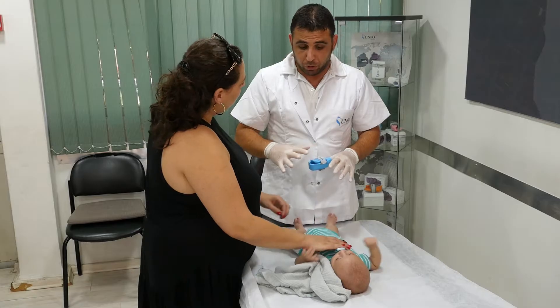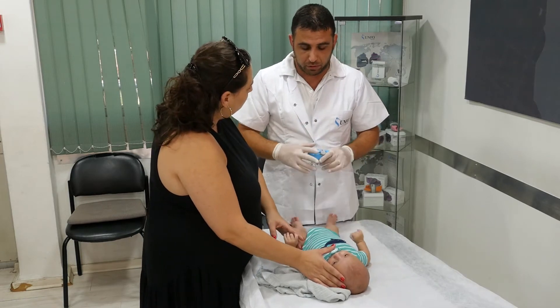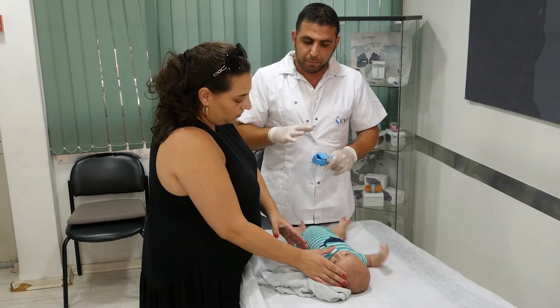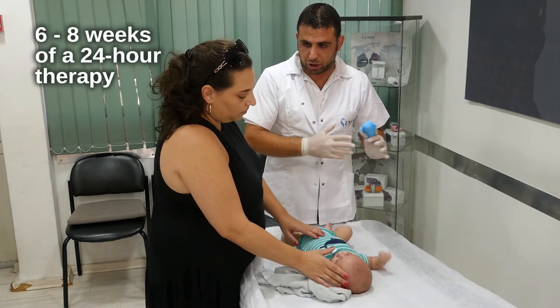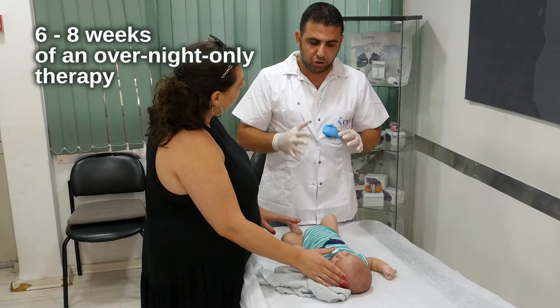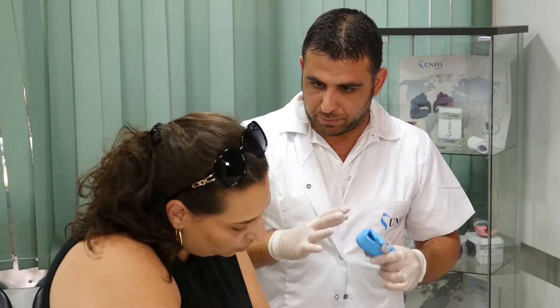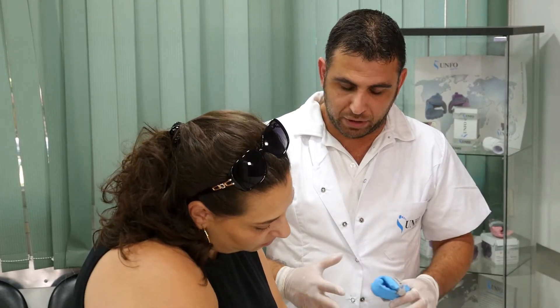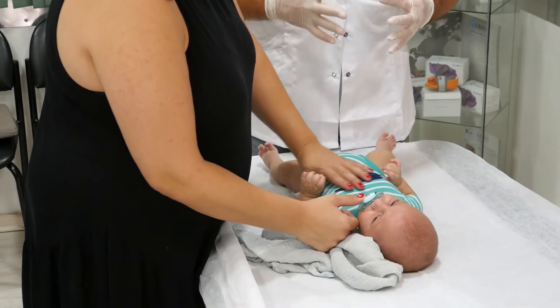Before setup, explain to the parents that the therapy is not painful for the baby and that the average therapy duration is between six to eight weeks of a 24-hour therapy, and then an additional six to eight weeks of an overnight-only therapy. The therapist is the only person to determine therapy duration, according to the severity of the case and the progress made during the therapy.